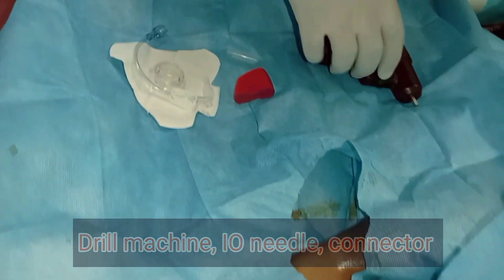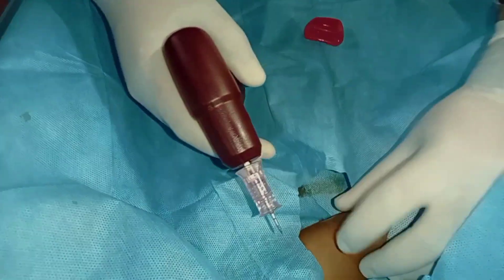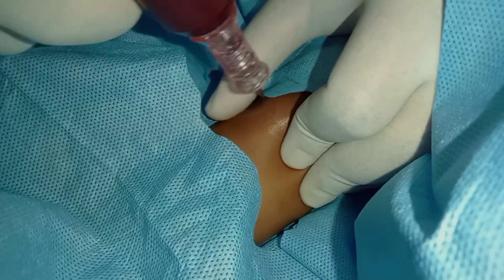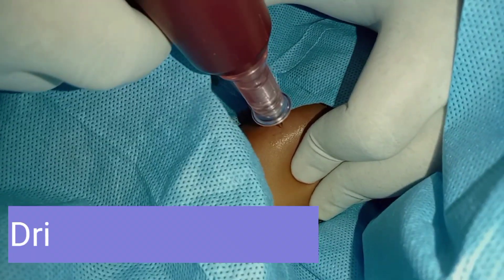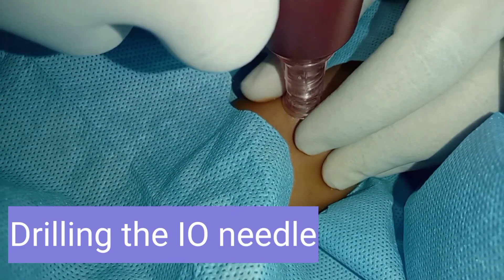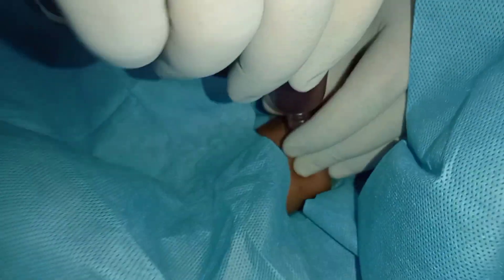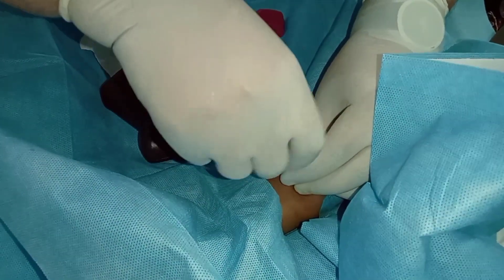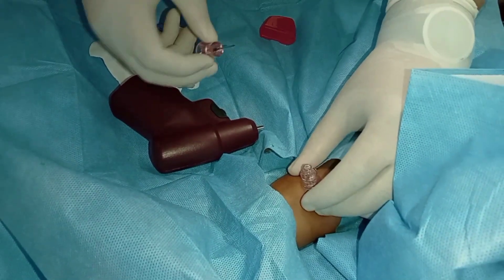Keeping the equipment here — the intraosseous needle in the middle with the drill machine and connectors on both sides. After assembling the intraosseous needle to the drill machine, it is time to fix the bony point with one hand and to insert the needle with the other hand. Once the needle is inside, a feeling of give-away sensation is felt, and the drill is disconnected. The needle is now very firmly fixed to the bone.